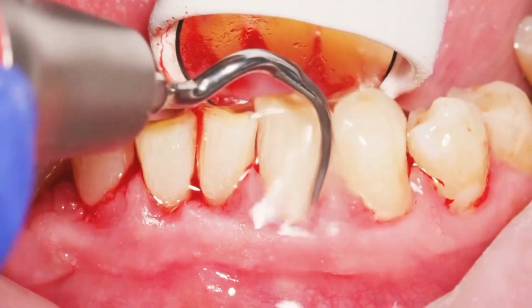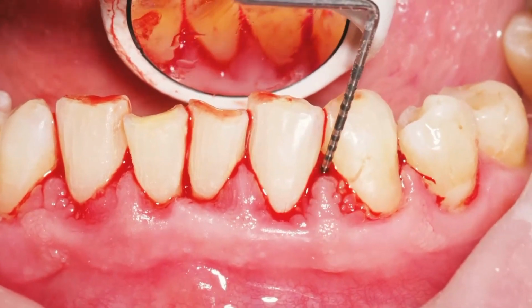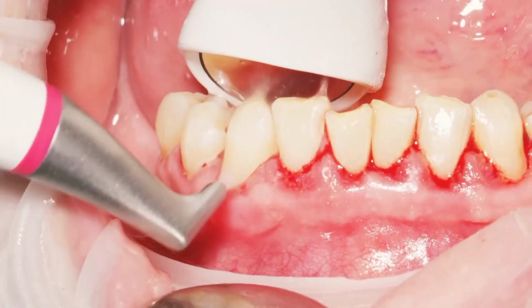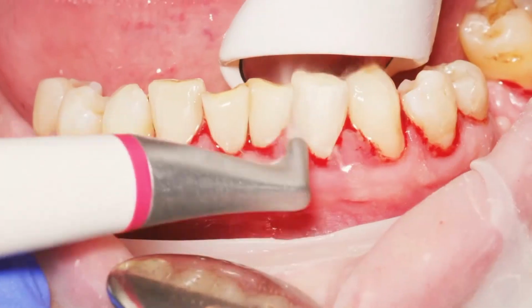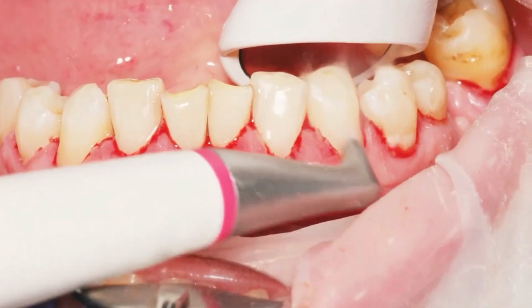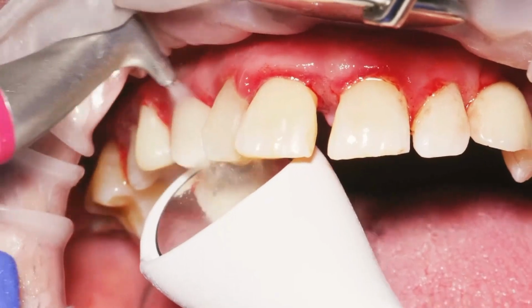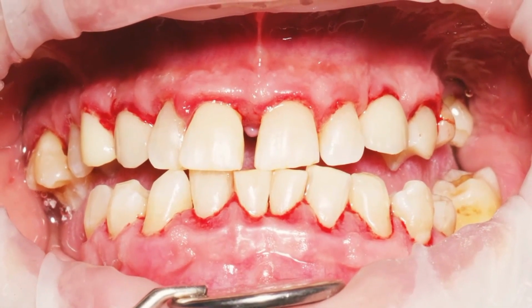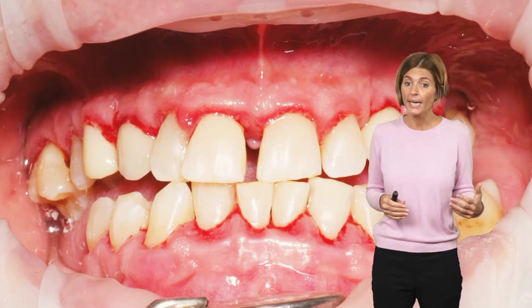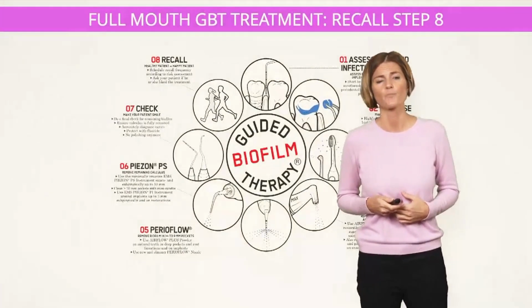And if we identify some calculus, some residual mineralization, we redo the piezo instrumentation, and where we remove the supragingival calculus, normally we refine also with the erythritol powder to be sure to remove all the biofilm that can remain under the calculus.